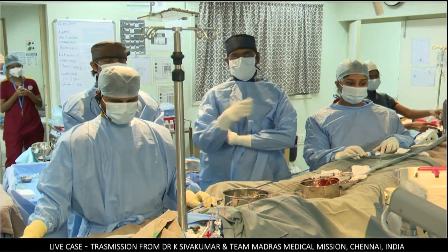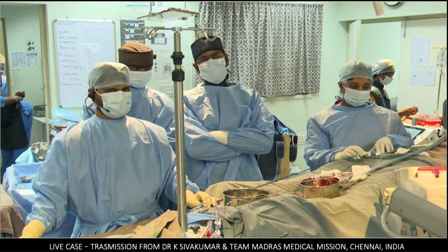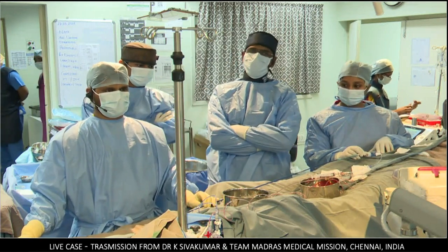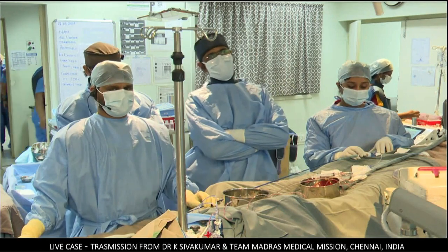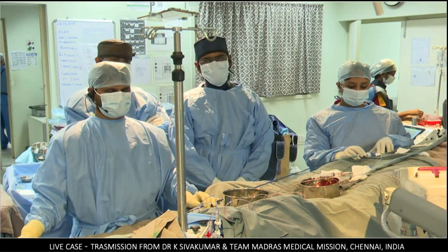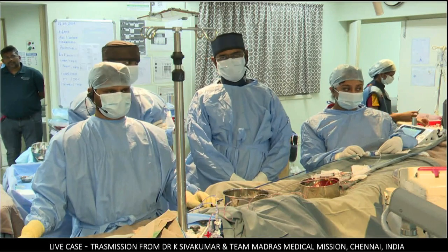Dr. Pramod, who is my colleague here, is the person who did the virtual reality reconstructions on the Vimedix platform. He basically dissects out the heart. He discusses a lot with Adam Kolesnik from Poland, and he gets the virtual valve implantation. The balloon size was 32 millimeter, and so we normally go for about +4. So we decided to go for a 36 millimeter.